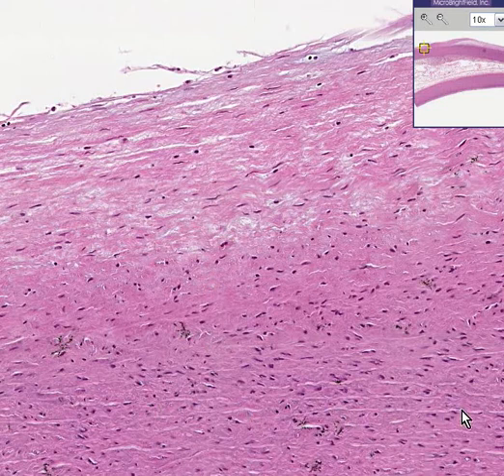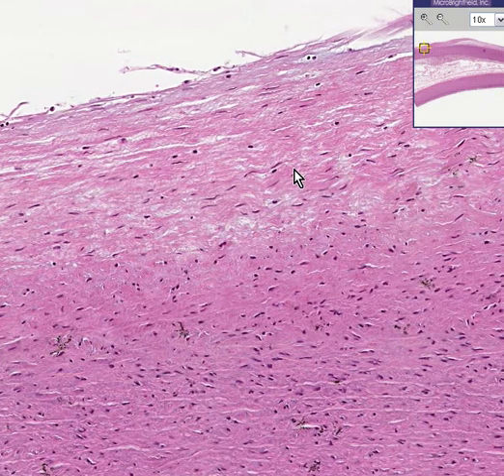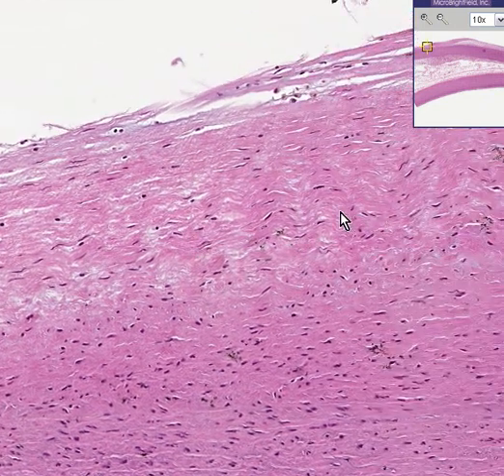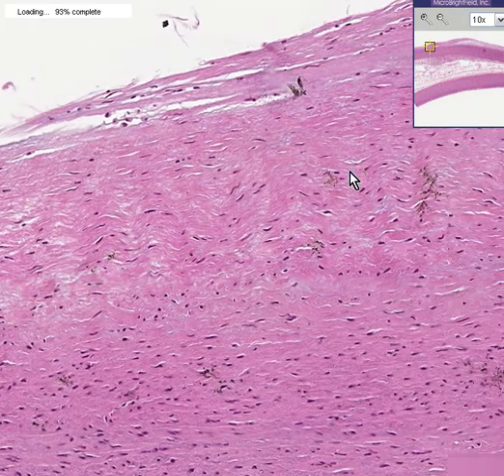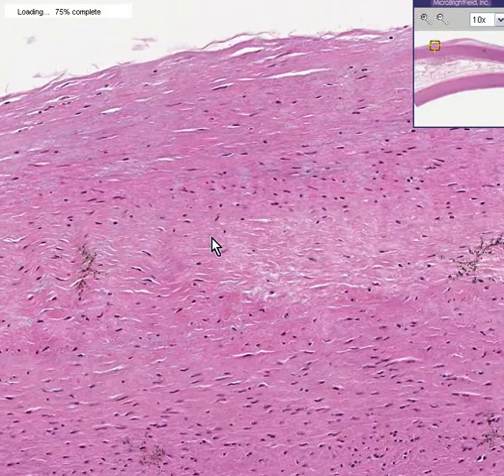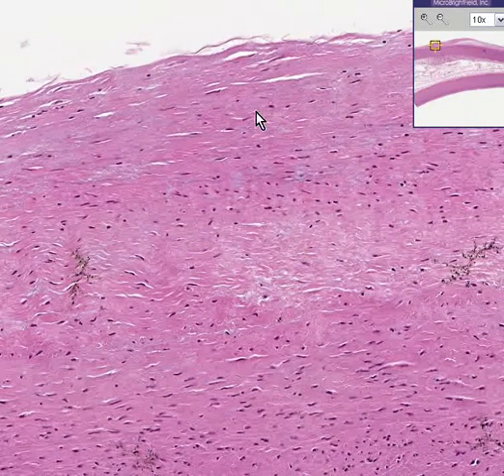Now, let's look at another part of this aorta, in which, once again, you can see these little wavy, whitish, slightly refractile lines representing elastic fibers through the wall, because the aorta and often its major thoracic branches are regarded as elastic arteries.